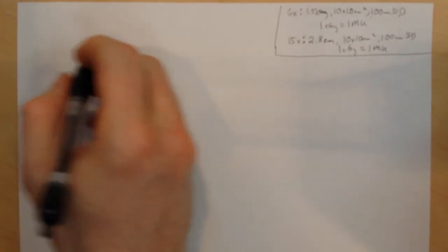So, talking about AP/PA setups. AP/PA setups are excellent because they're fast, they're easy for the therapists, the calculations are simple, and for the physicians, it's hard to miss your target when you're using an AP/PA setup. So it allows for a more lax immobilization.